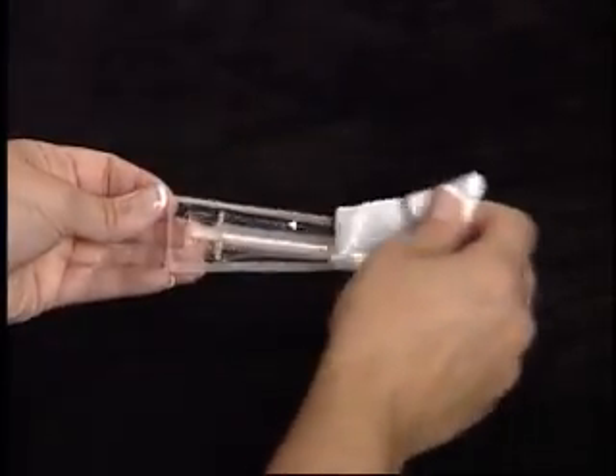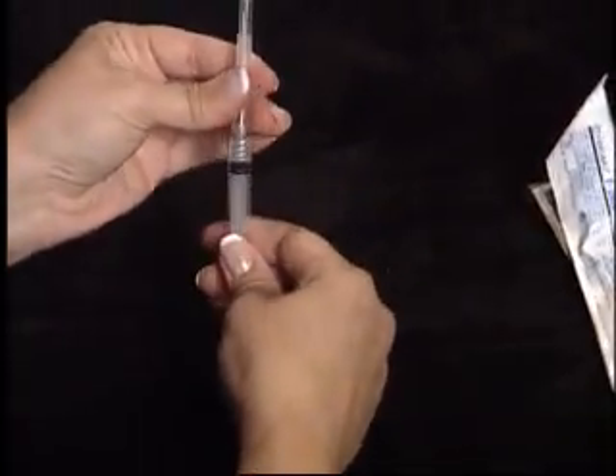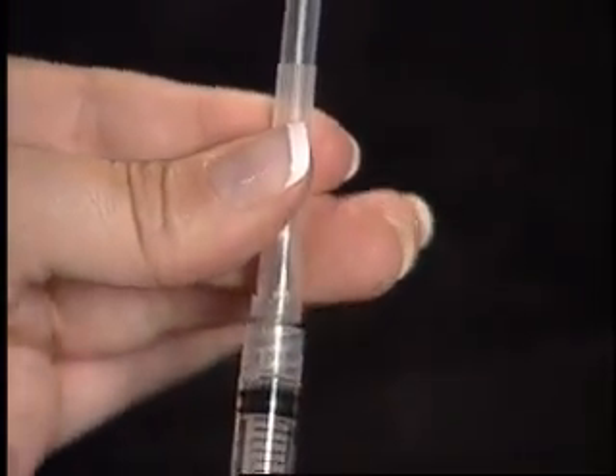Open your 3 cc 1½ inch syringe and twist the needle to secure. Remove the cap.